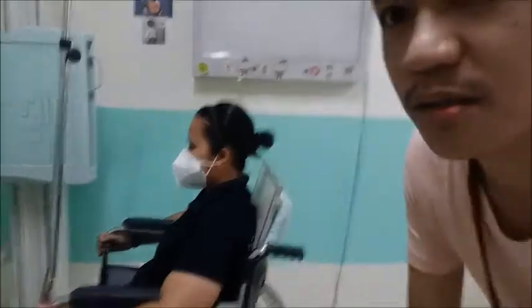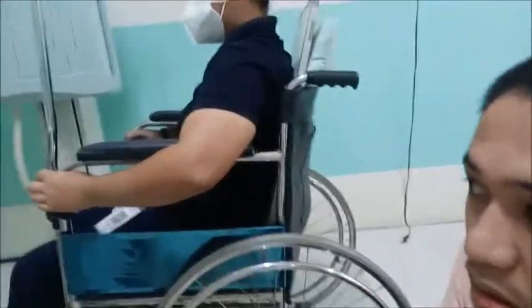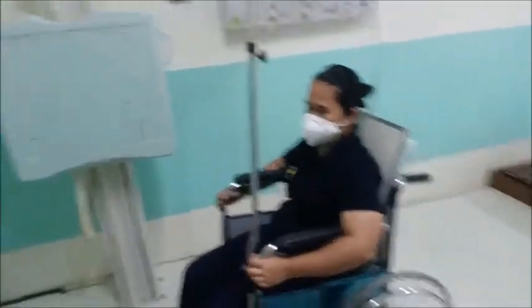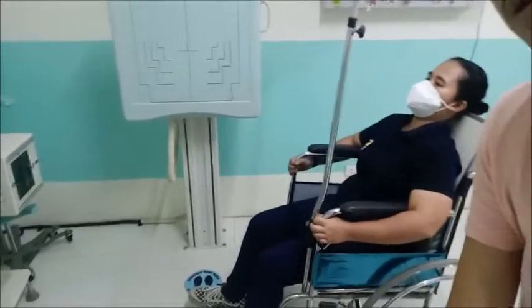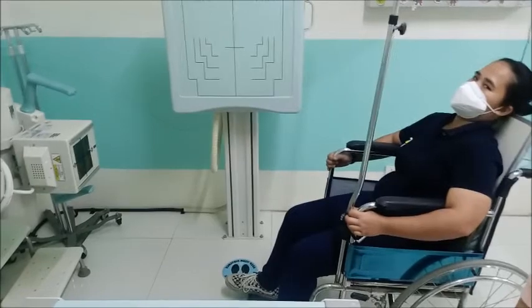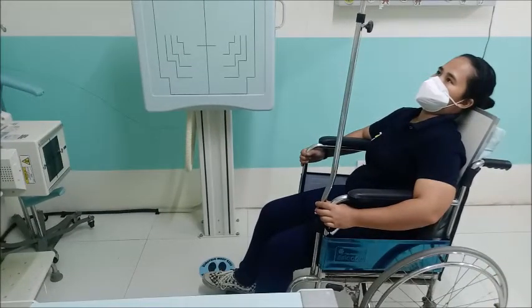So, if you look at the cassette in the wheelchair, it is slightly tilted backwards. So what to do? You just need to adjust your tube, especially for wheelchair patients whose back is very stretched. So just adjust your X-ray tube.